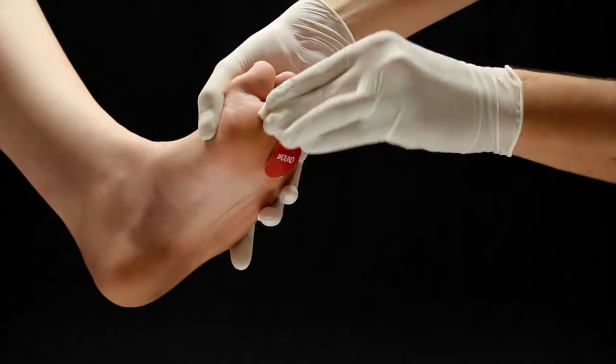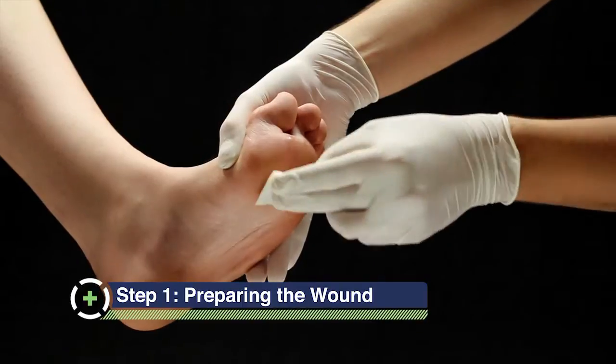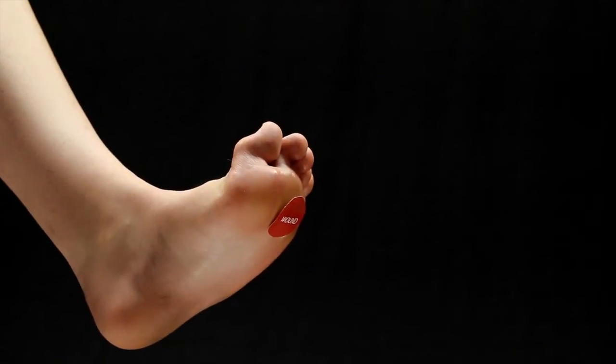Clean and prepare the wound in accordance with facility protocol and allow to dry. Assess the wound size and type. Apply skin prep to the peri-wound skin around the wound and areas under the dressing adhesives.